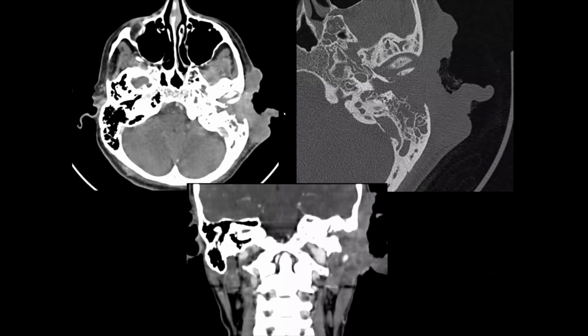This is a very large basal cell carcinoma. You can see it completely replacing the left auricle here and filling the left external auditory canal. It even extended into the middle ear cavity. And then on the bone windows here, you can see frank bony erosion and destruction of the mastoid complex and the walls of the EAC, both anteriorly and posteriorly.